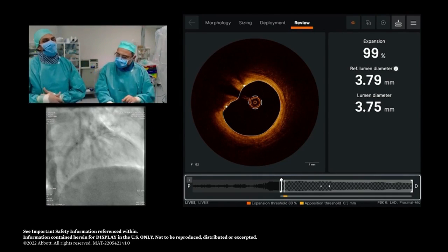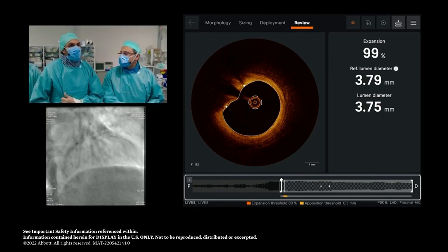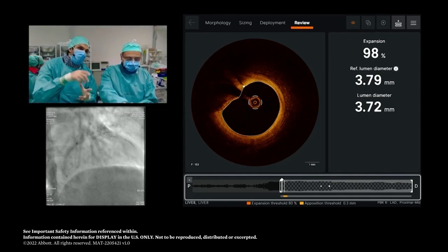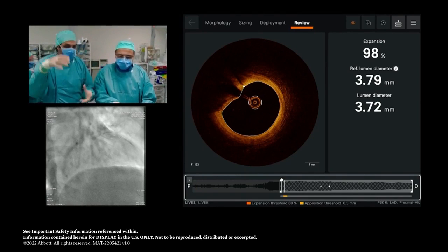So a short post-dilatation there, and then we do final pressure gradient assessment, and we're done. Perfect. And I think we should go with a 4 semi-compliant balloon because we don't want to post-dilate, we just want to oppose now. Okay.